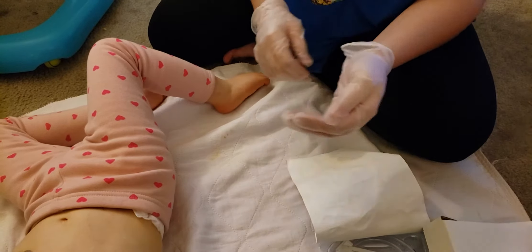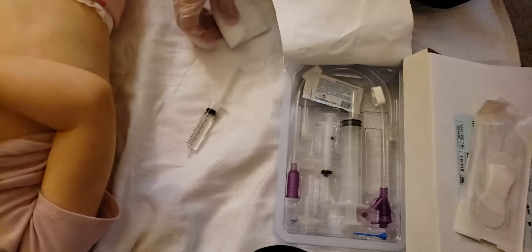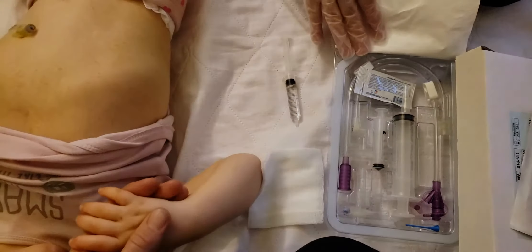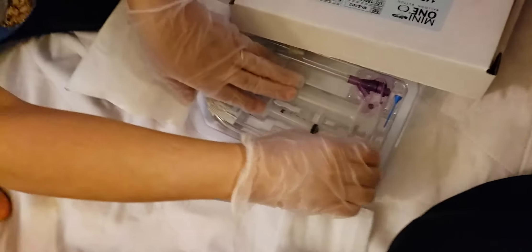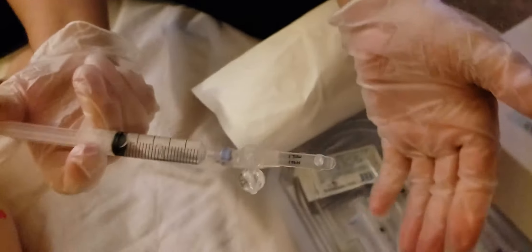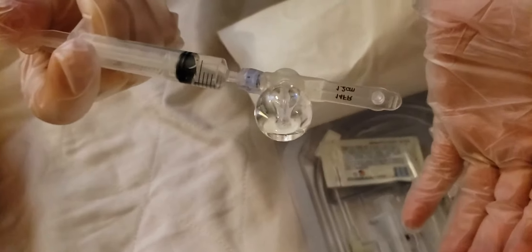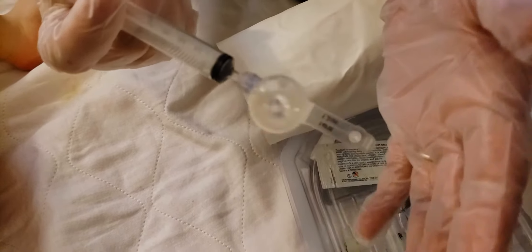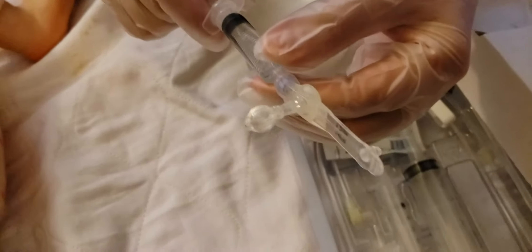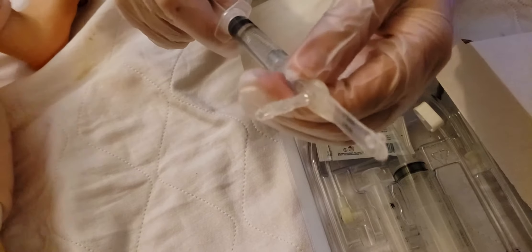I've changed many g-tube balloons now, and I just wanted to show everybody exactly what you're doing. The first thing you're going to want to do is take your balloon out and make sure there's nothing wrong with it. You want to fill up the balloon — this is what's inside Annabella's belly — and extend it fully with 5ml of water. There may be a little air bubble in there, but just to check that nothing's wrong. Then I always like to pull all those little air bubbles out so that it works properly.